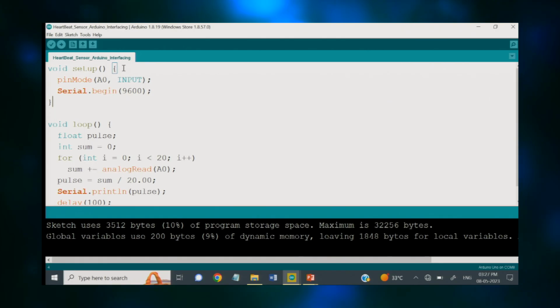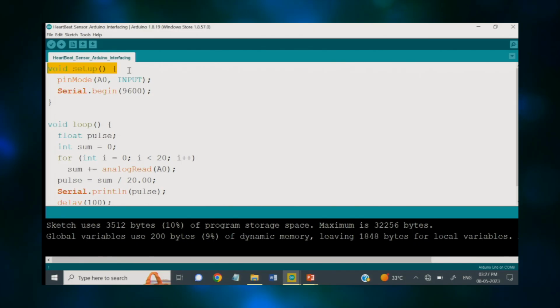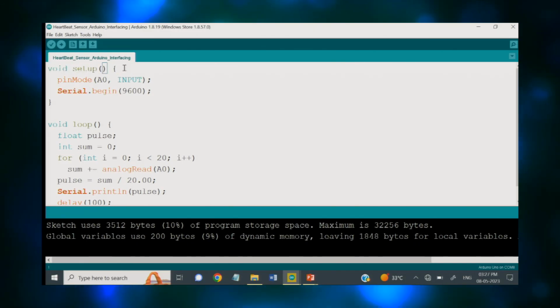For this particular connection, let us now see a simple code that we will design with the Arduino IDE software. Here on your Arduino IDE terminal, we have opened the void setup section first of all. As this particular sensor does not require any kind of library for the interface, you can see we have not included anything like that, and we are starting directly with the setup part.